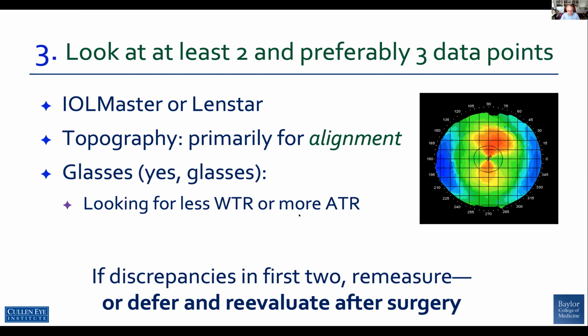But if I don't have clear answers, I will remeasure my patients. And if I still don't have clear answers, I tell them that I think we should just wait, reevaluate them after surgery, and then we can decide what to do.